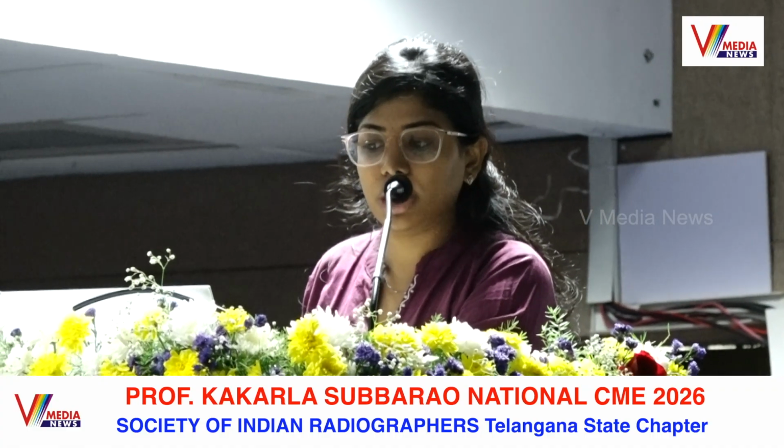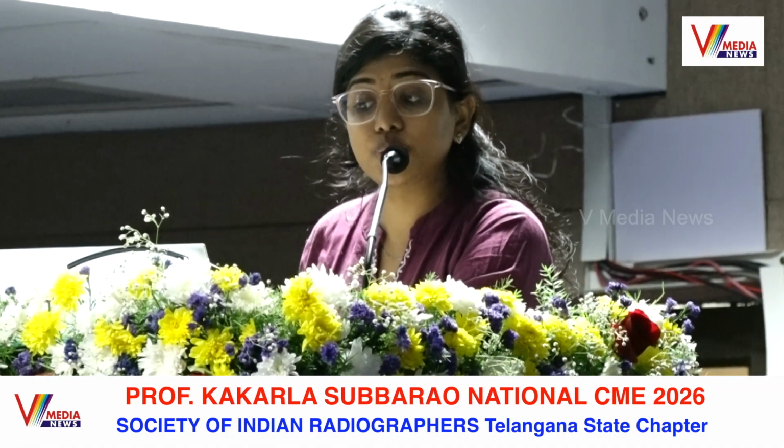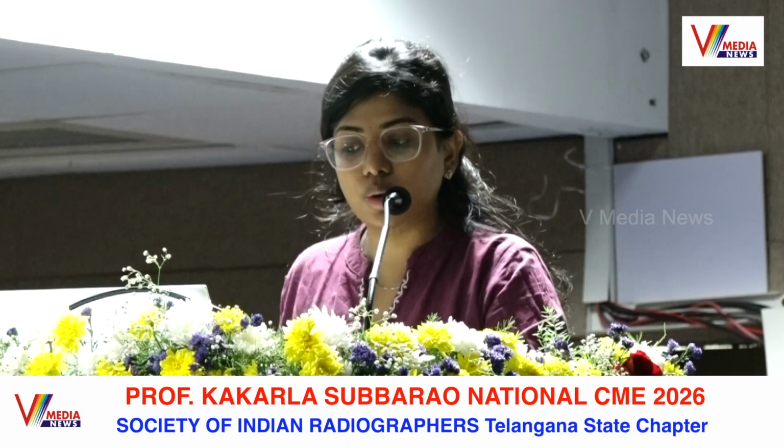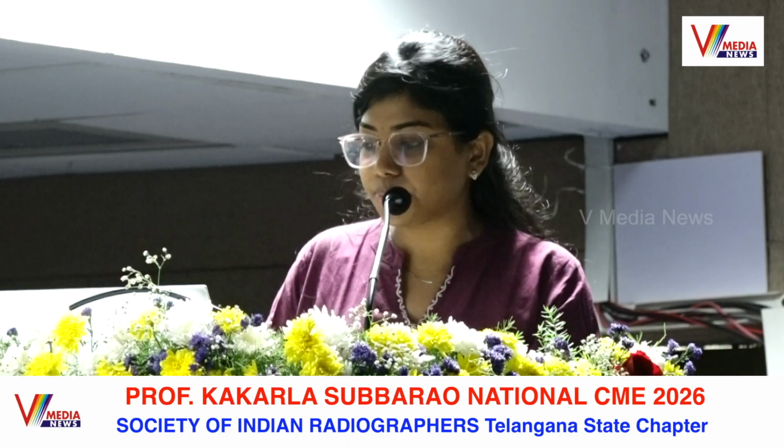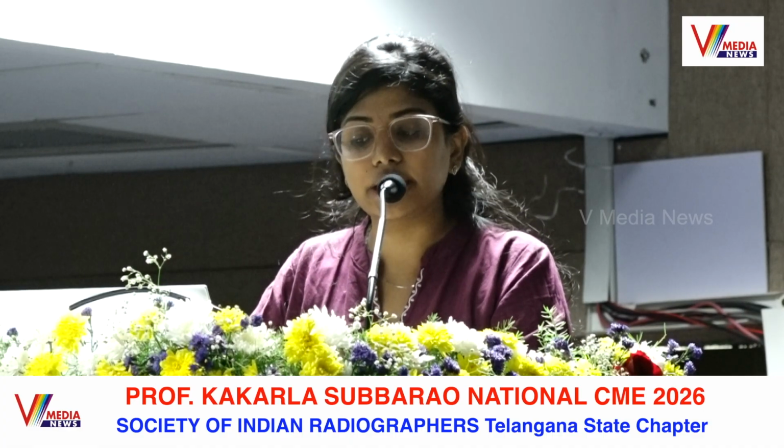So this is the overview of the CT coronary angiogram. I will explain this further. Starting with the CT angiogram, it is an anatomical imaging modality that allows for visualization of the coronary artery lumen and wall using an IV contrast agent. It is now considered a first-line test for use in acute and chronic coronary syndromes in symptomatic patients. And it increases the diagnostic accuracy in detecting calcified plaque, arterial narrowing, acute plaque, arterial stenosis and arterial anomalies.